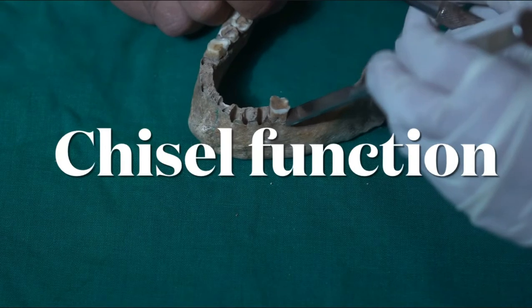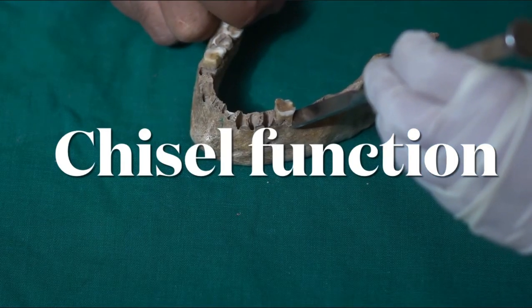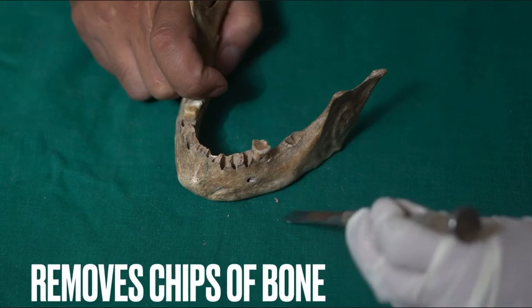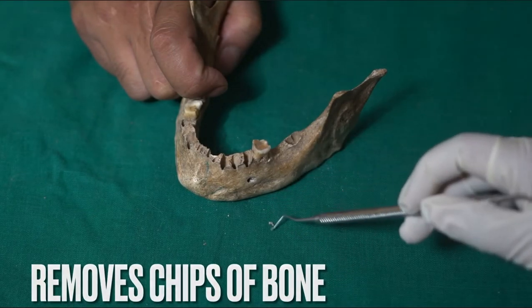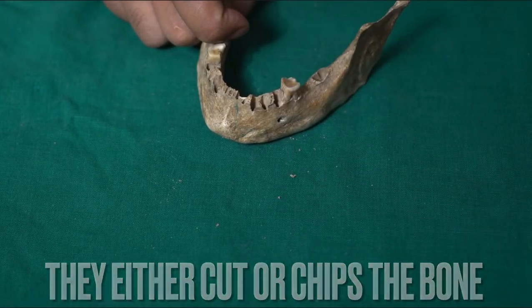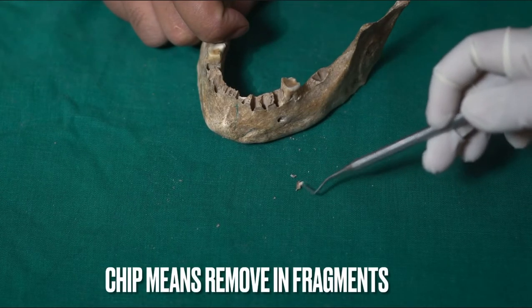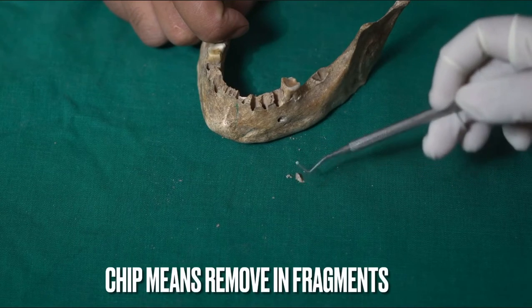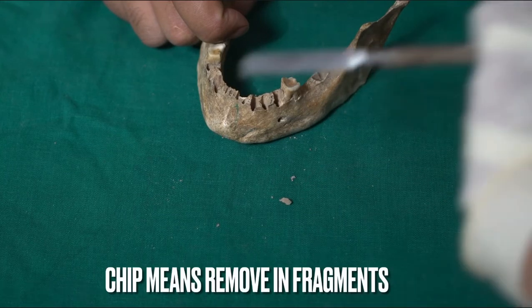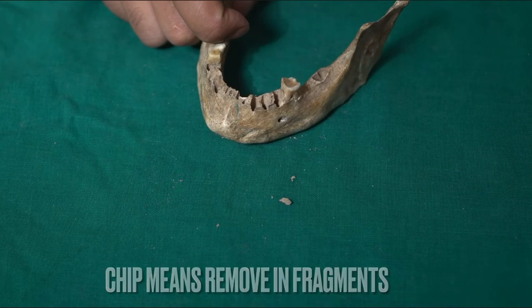Now for the functional difference: in cases of difficult extraction — for example, when a tooth is not coming out with forceps or an elevator — you can use a chisel or an osteotome. What the chisel will do is remove chips of bone. Unlike the osteotome, it does not split the bone as a whole; rather, it removes the bone in a fragment-wise manner. As shown in the video, we remove bone fragment by fragment from each side and then extract the tooth.